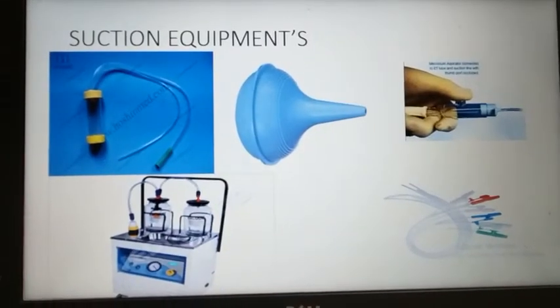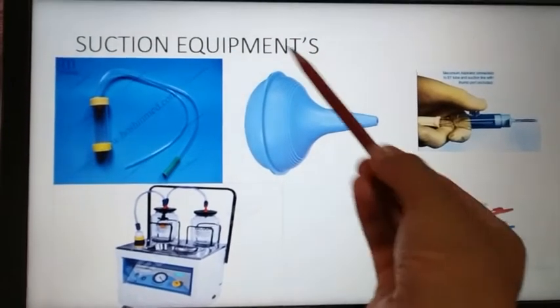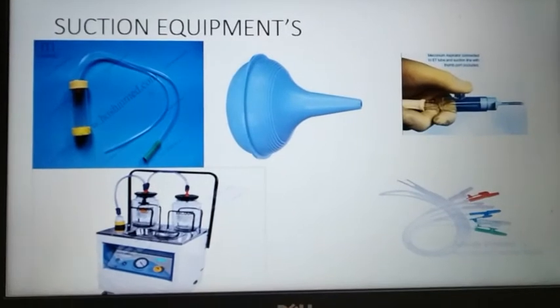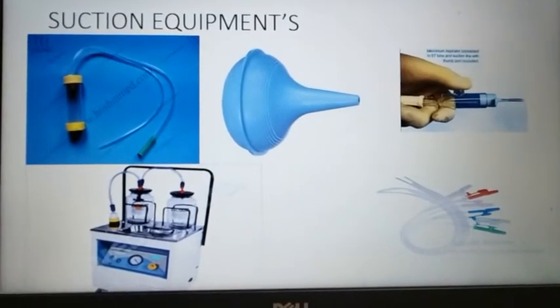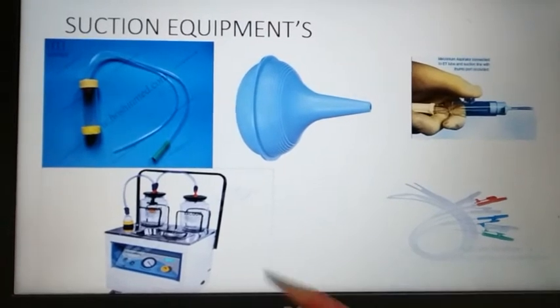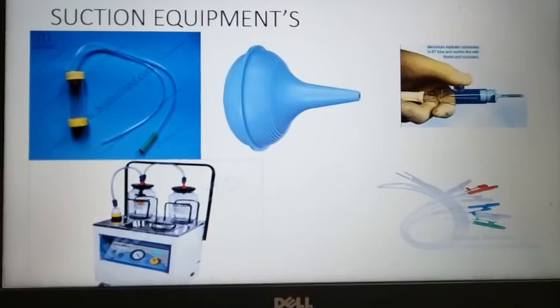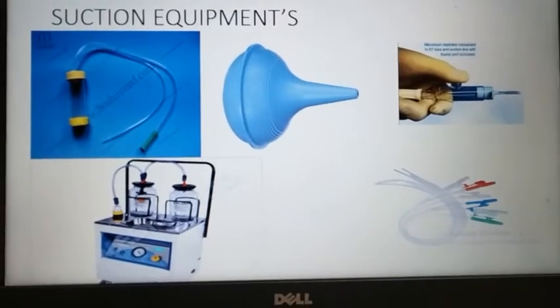First we will see suction equipments. These equipments are helpful in removing secretions from the mouth, nose and from the trachea. These are the equipments that will help in maintaining the negative pressure so that they can suck the secretions from these organs.